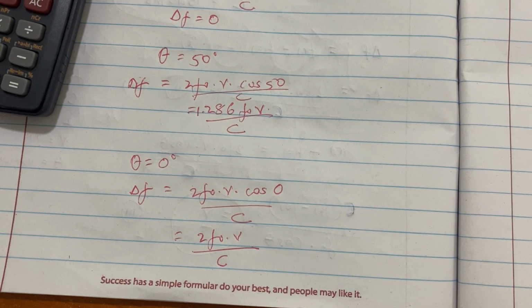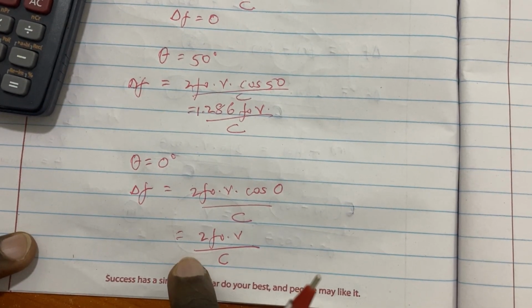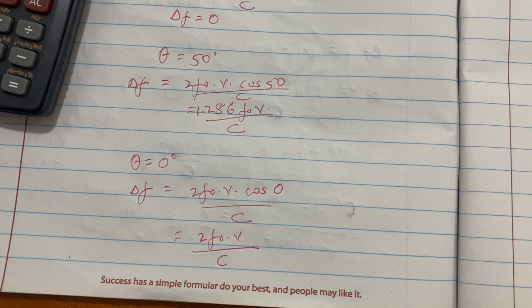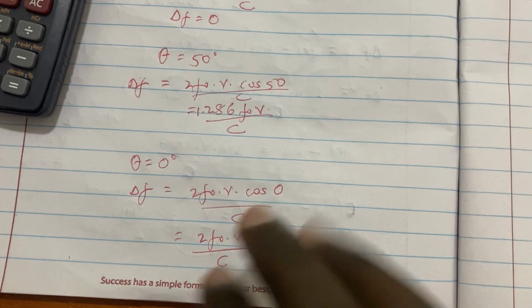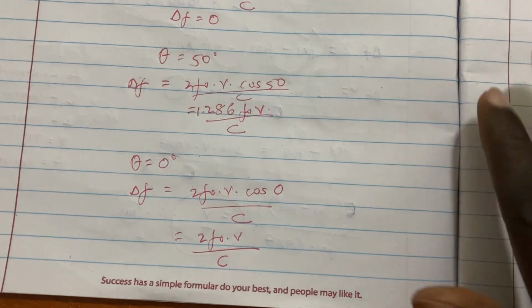We try to be as parallel to the direction of blood flow as possible. Because of this, we have now seen the bigger the theta, the lower the Doppler shift. That's why I was telling you that we have to be as parallel as possible.